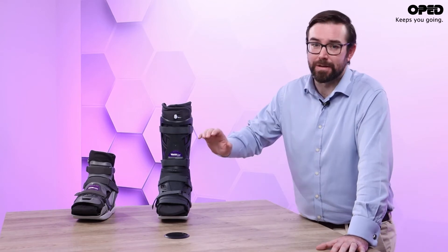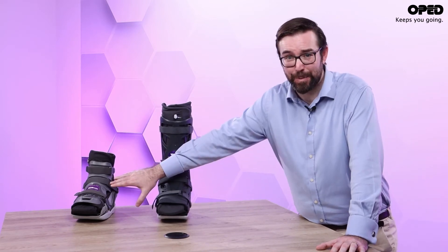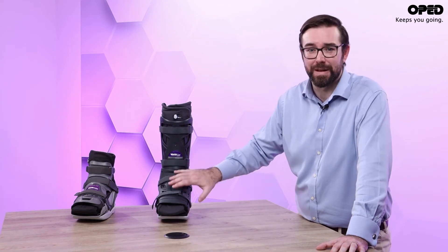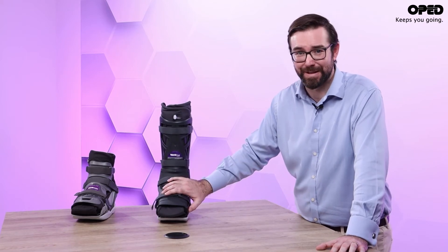Improved offloading will lead to faster healing times and hence significant savings on clinicians' time and costs. Should you have a patient that won't conform to a knee-high orthosis, we have the Vacapedus Diabetic, which can be used as a step down from the knee-high as healing progresses, but also uses the same total contact technology as its larger variant.